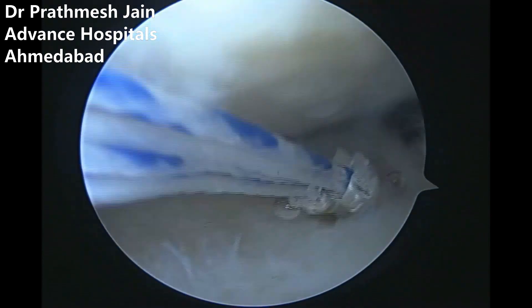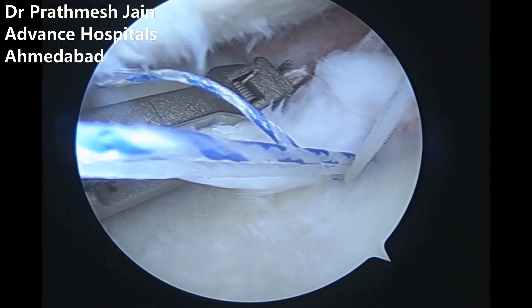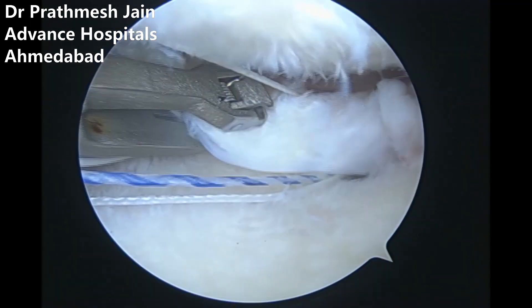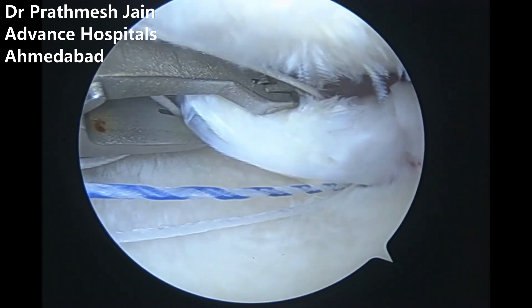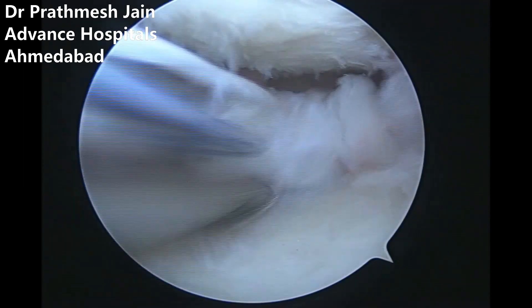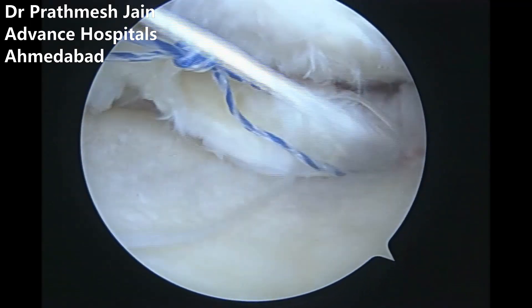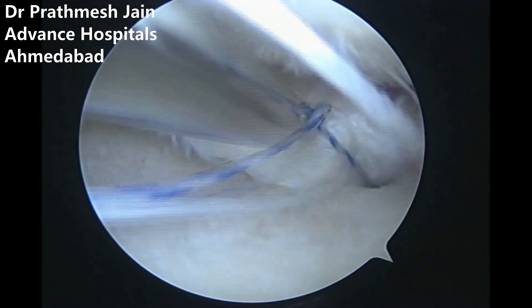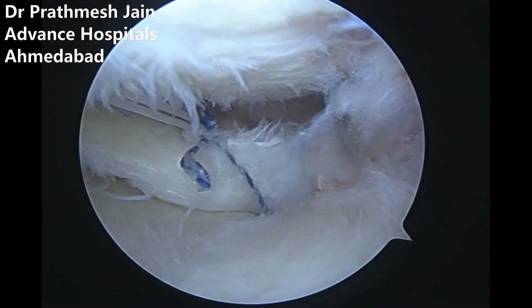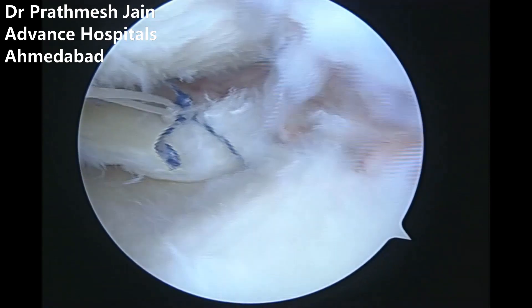The anchor is pulled very gently and as soon as it goes into the chondral area, it locks there. We then use our knee scorpion device to pass the sutures one by one. We repair in a Mason-Allen fashion — like a single-row rotator cuff repair. The blue suture is a simple stitch and is tied first, reducing the root into its place. After that, the white suture is tied in a mattress fashion — forming a Mason-Allen knot — which reduces the root very nicely onto its place. This is a very solid repair of the meniscus root.